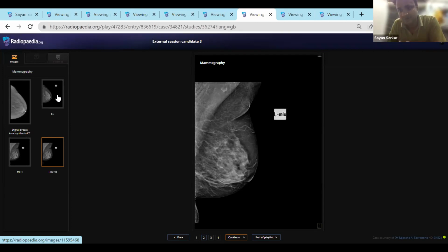Just tell me what you do in usual practice; this is just a normal discussion. As well as the axillary lymphadenopathy, I look for loss of fatty hilum in the axillary regions, and I'll do the other breast as well. Then I correlate both together, the mammo and ultrasound findings. So in the same breast, what will you see? Is there anything that you look for in the same breast where the lesion is, before you go to the other breast?